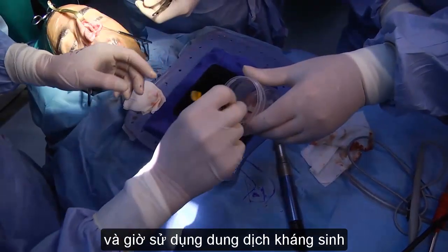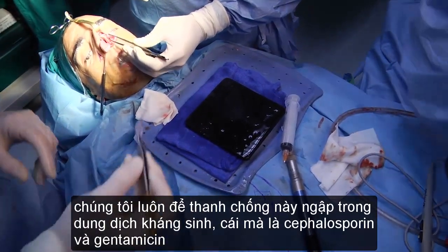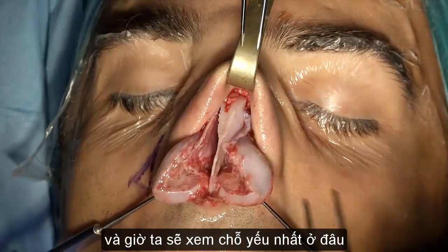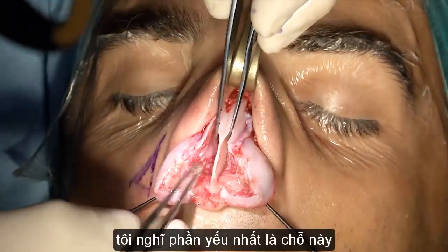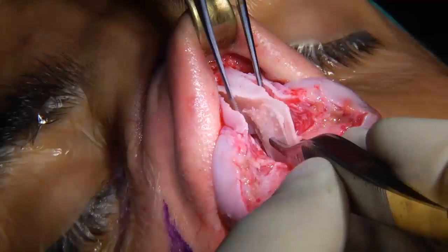Okay, antibiotic solution here. We're always keeping these grafts swimming in antibiotic solution, which is what? Cephalosporin and gentamicin, right? So let's see where the weakness is. I think the worst portion is this one. So this is also for demonstration, really.